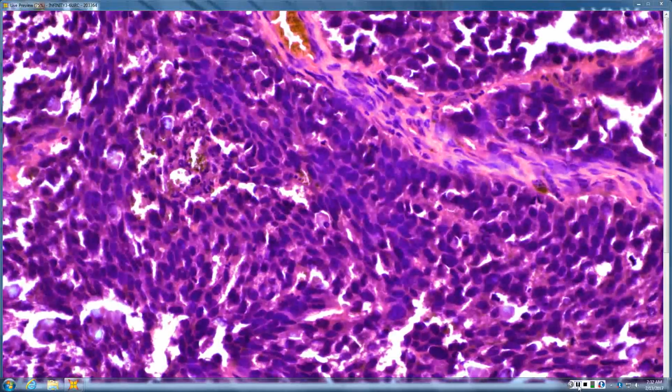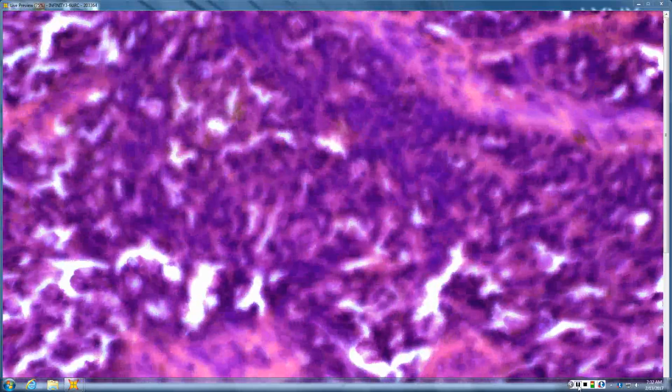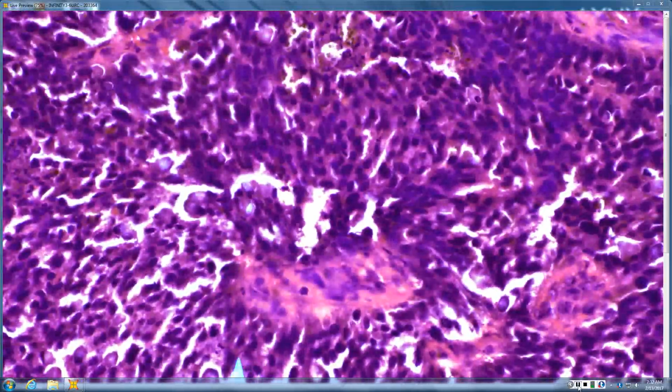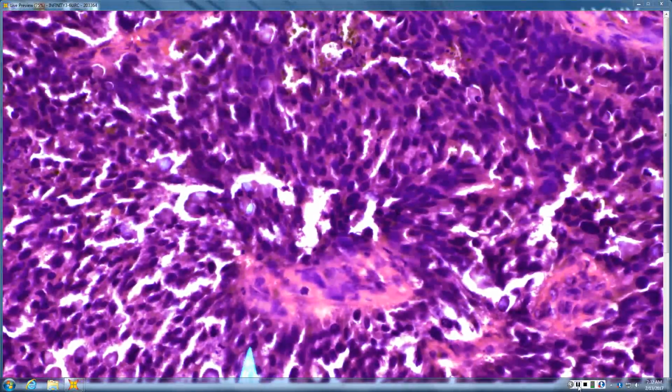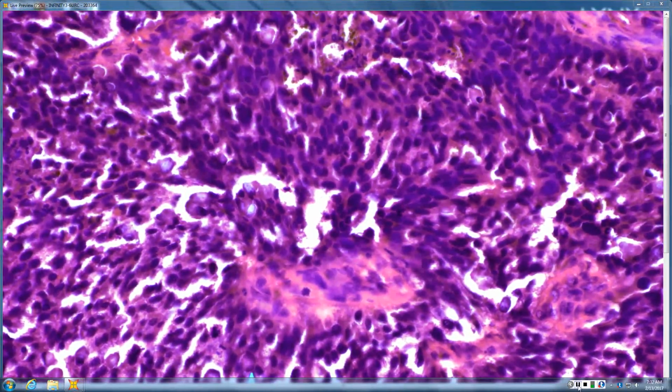And certainly lots of mitotic figures everywhere you look. Cells are highly malignant, and then you have some cells that have this morphology. See how you have a big round cell with red cytoplasm and a nucleus off to the side? Mm-hmm. And there are lots with that morphology. That's called rhabdoid. So in rhabdomyosarcoma, you have cells that, oh, that looks just horrible up on the screen, doesn't it?